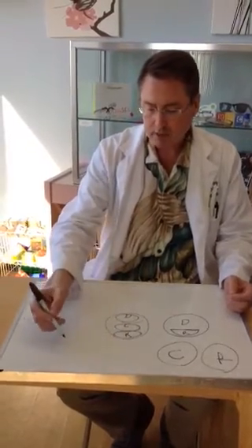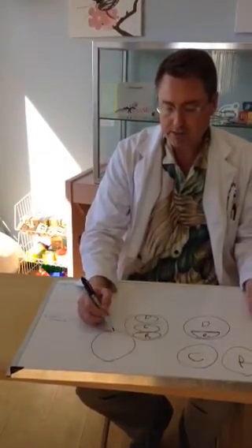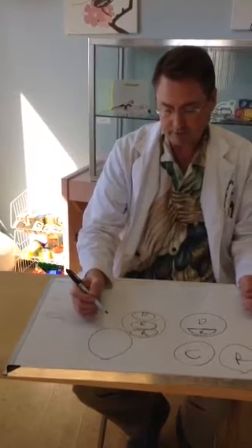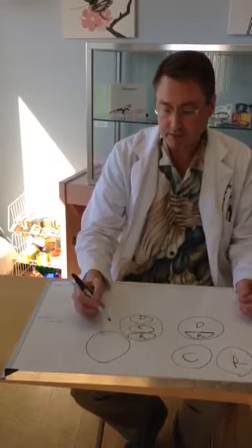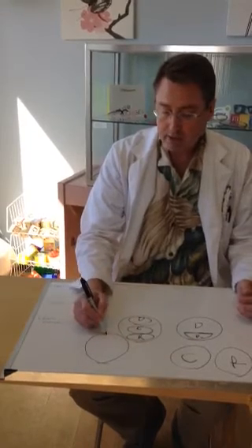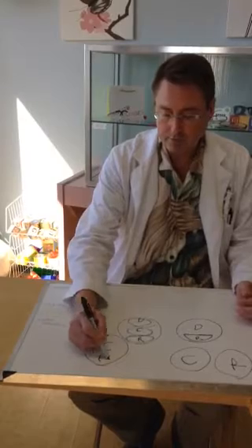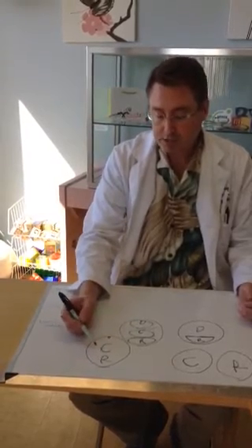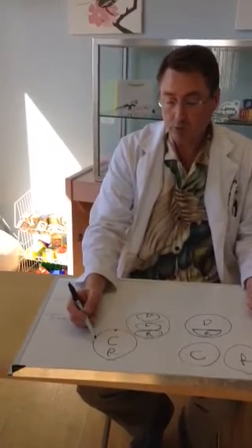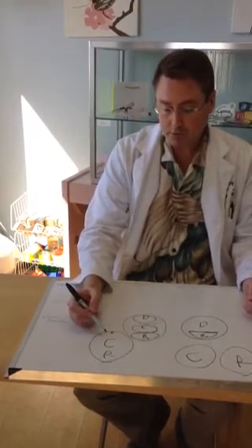There is a new idea that's on the market now, and it's been really popular. And the idea is it is a progressive lens, so the prescription is changing progressively, and also cosmetically it's nice because there's no line. You have distance portion, you have computer, and you have reading. And this is called an occupational progressive lens or room distance progressive lens. And the idea is to be worn indoors only.